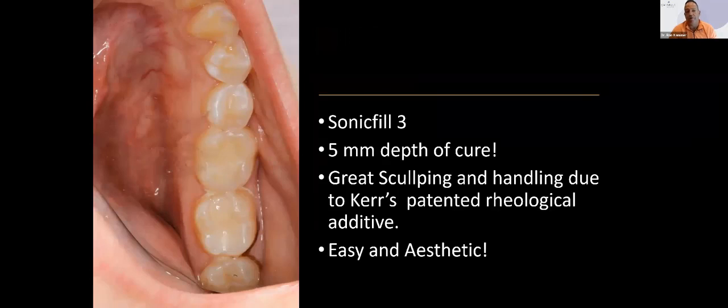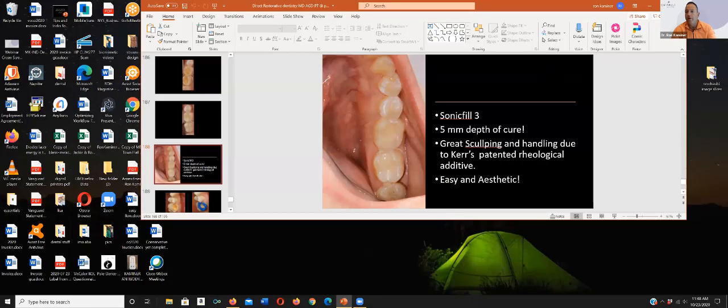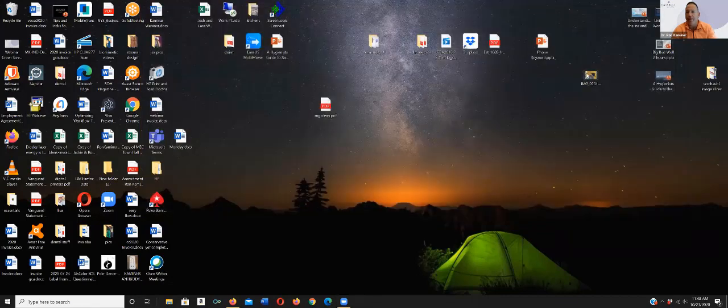Don't get it on the tissue like I just did. You'll get a little chemical burn. You'll rinse it off. We then applied an RMGI, and then went through an adhesive process, then placed our adhesive, then our composite. So the bottom line was, that's how you know when to stop using that potassium iodide. Now I'm going to take you through this in a video to show you what I just did, except you won't see that precipitate because I'm working on an extracted tooth.